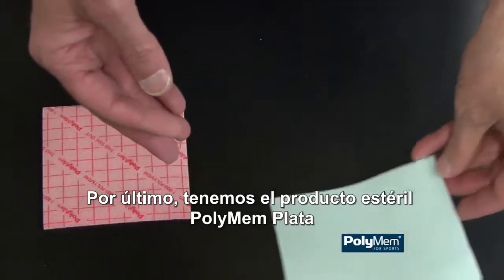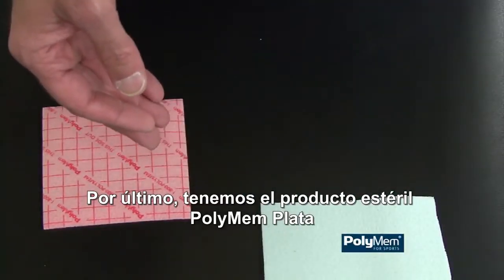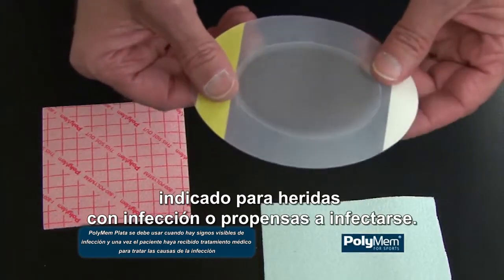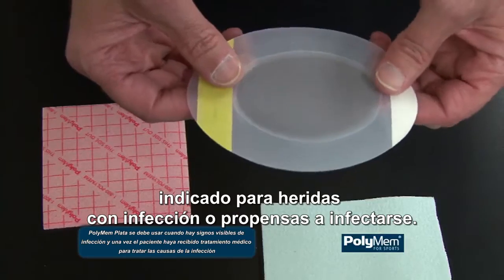Lastly, we have a sterile product, PolyMem Silver, as an antimicrobial dressing for wounds that are infected or may be prone to infection.